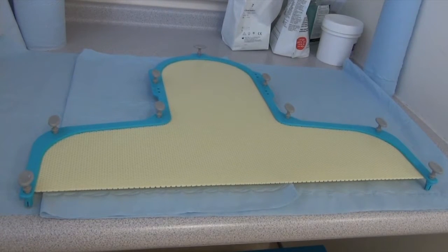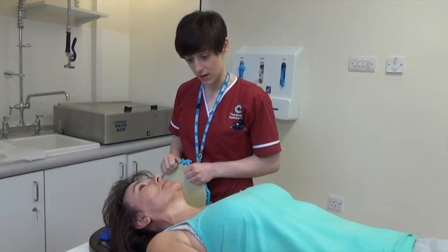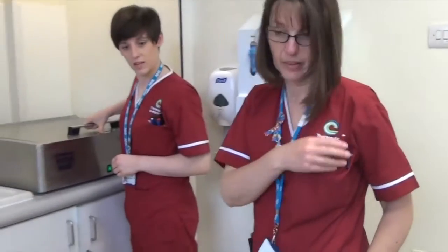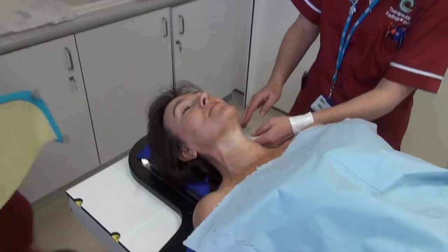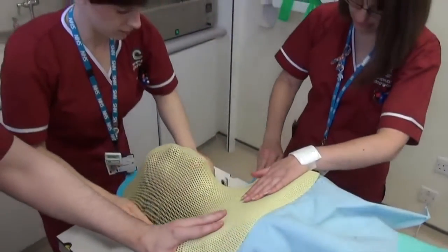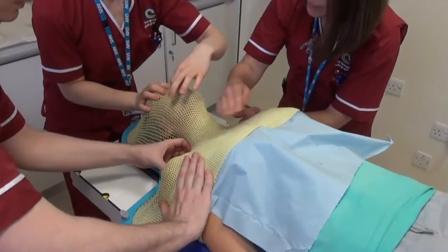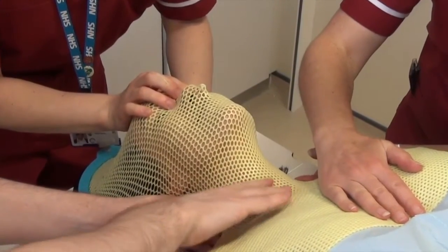The thermoplastic mask is placed in warm water and then applied to the patient while still warm and wet, with the patient's eyes closed. It is moulded to the face as it sets. The accuracy required is two to three millimetres, and for stereotactic radiosurgery as little as one millimetre. The patient should not be able to move, and when the rationale is explained to them they are willing to comply.